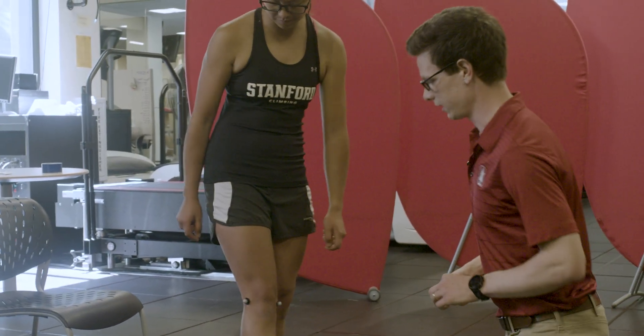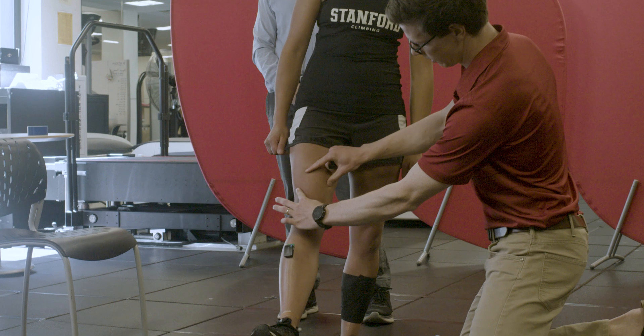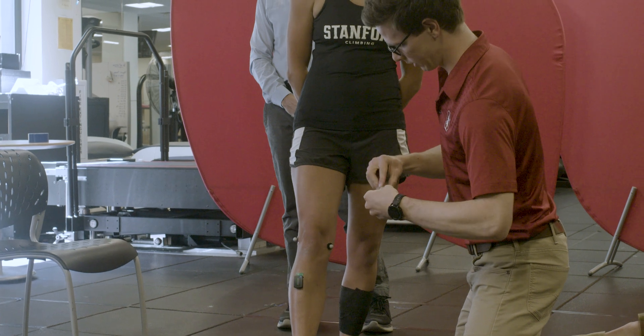The next electrode is the vastus medialis, which is the medial side of her quadriceps. For this, we'd have her extend her leg and flex her quads. You can see the muscle belly of the vastus medialis, and it's kind of pinnated into the patella, so we'd put it at a slight angle.